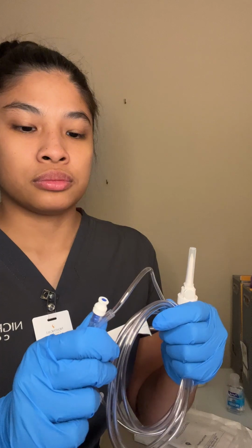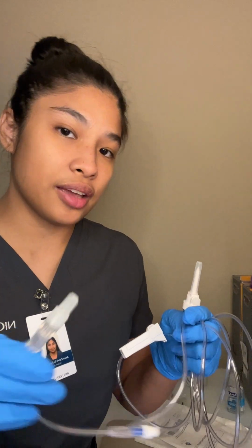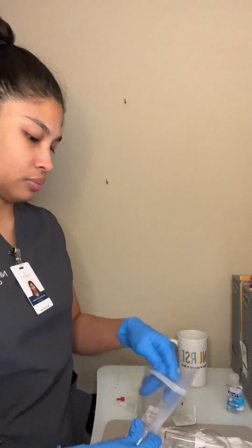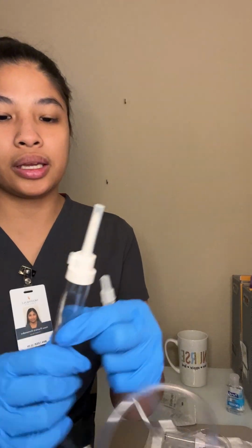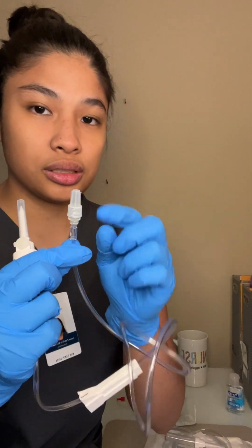Next, this is the white port. This is where you'd usually be connecting push medications or piggyback, like how we're going to be doing today. And this is the adapter end, which will be connected to the patient's IV. Next, this is the piggyback tubing. Same, it has a spike, a drip chamber, a clamp, and this is what will be connecting to the white port.